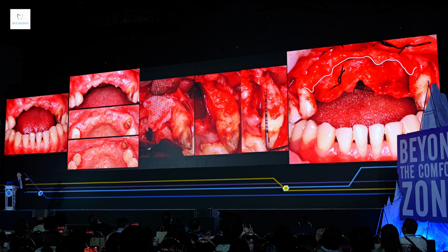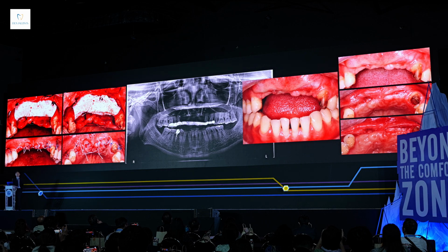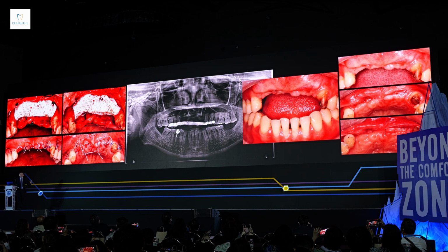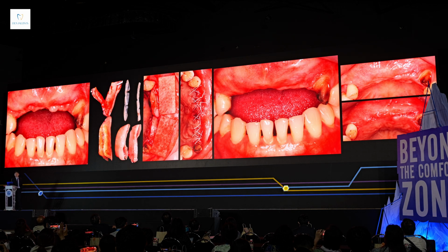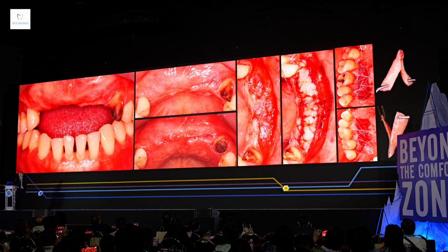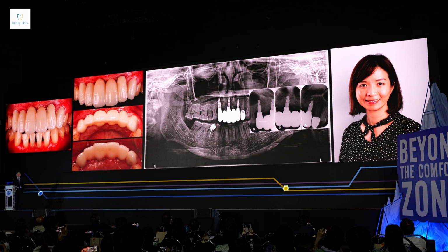Because there's an open bite, it's even larger. But our patient didn't want to correct the open bite, so I grafted it, just trying to gain the bone vertically as much as possible. Luckily, we had enough bone vertically. Then we were able to place 3 implants for the edentulous area. Of course, I did a connective tissue graft followed by the free graft. That's a very old case, so I did it that way.